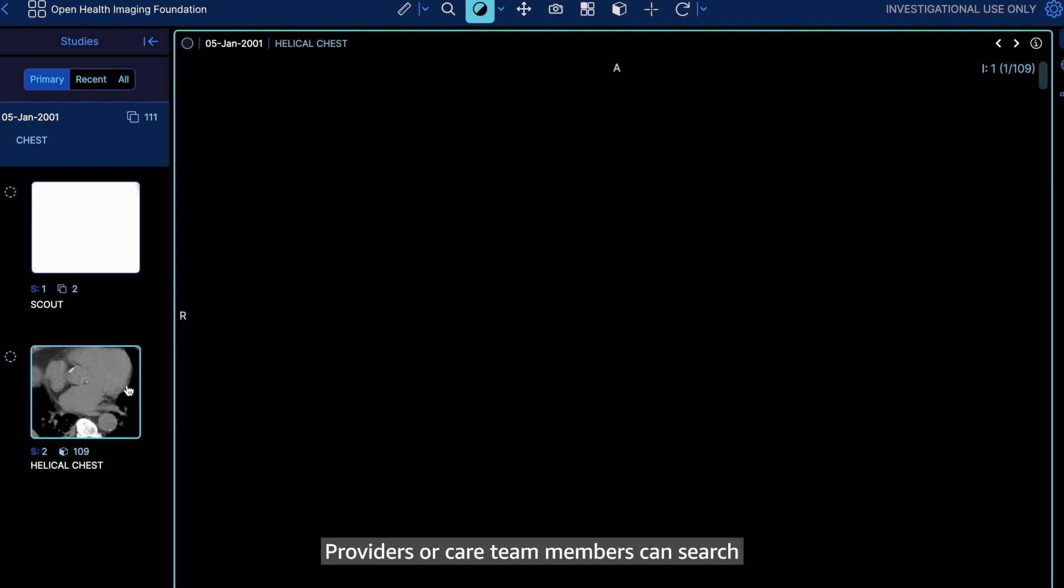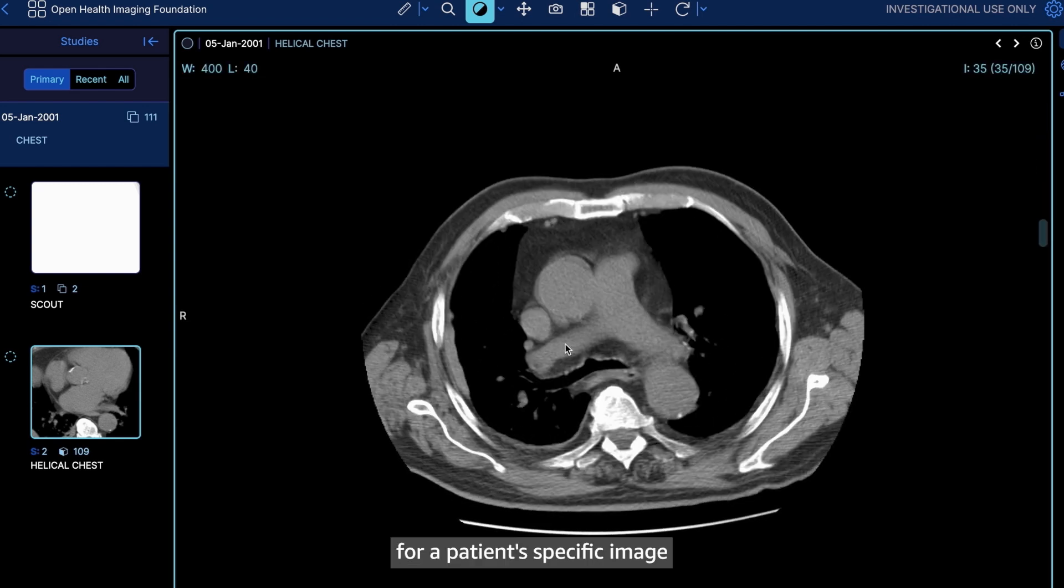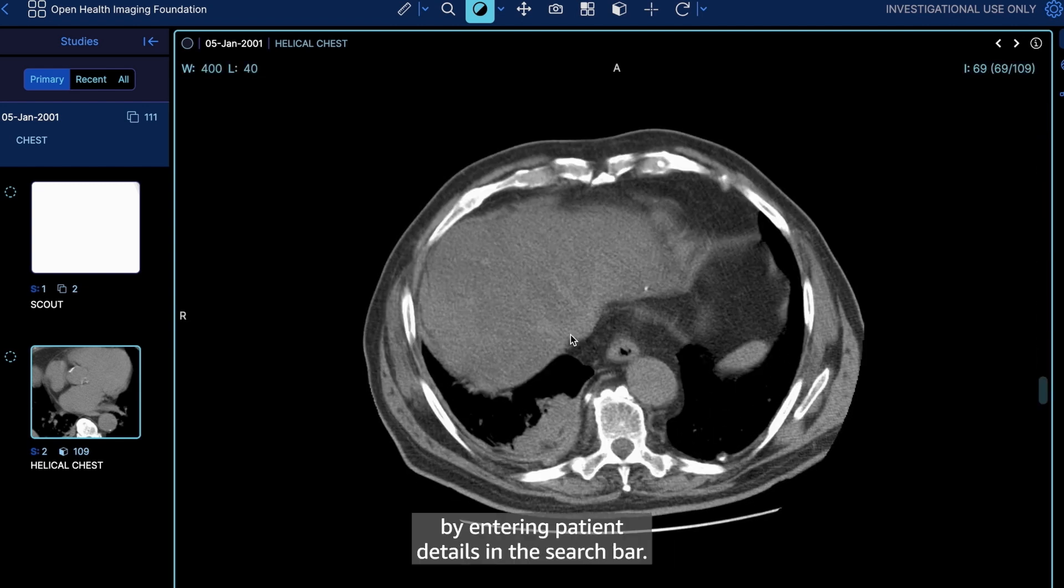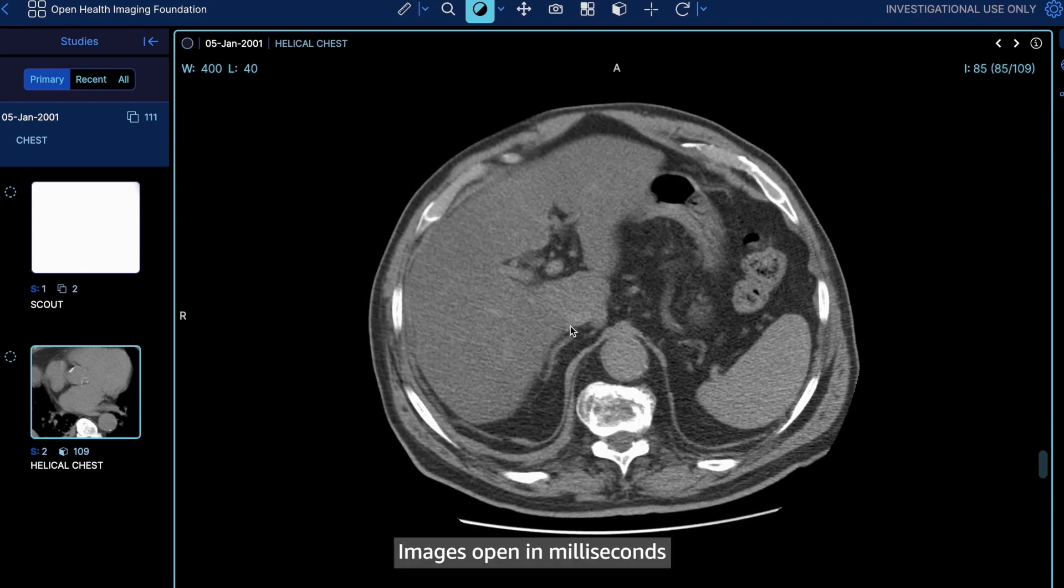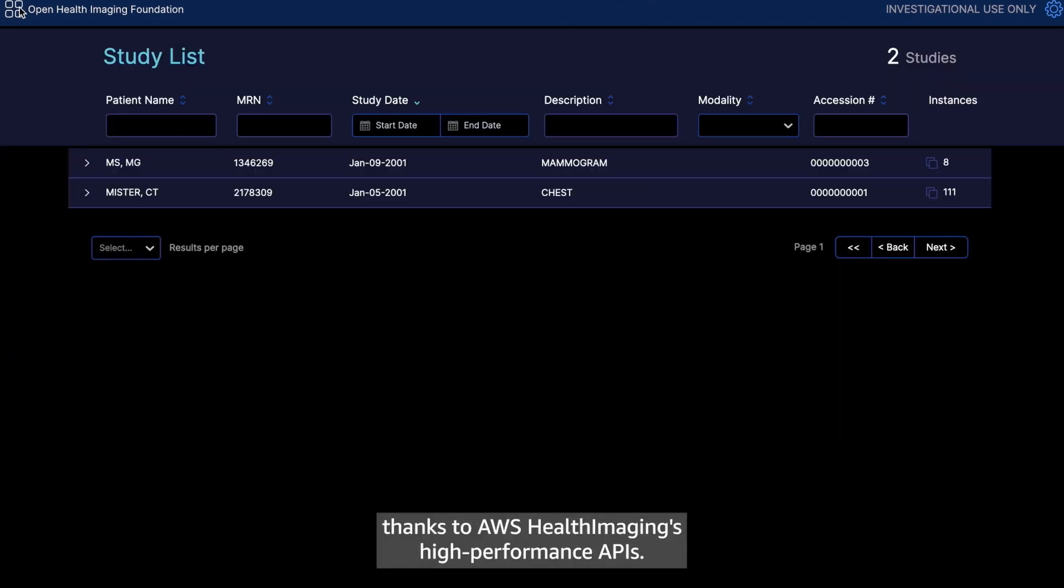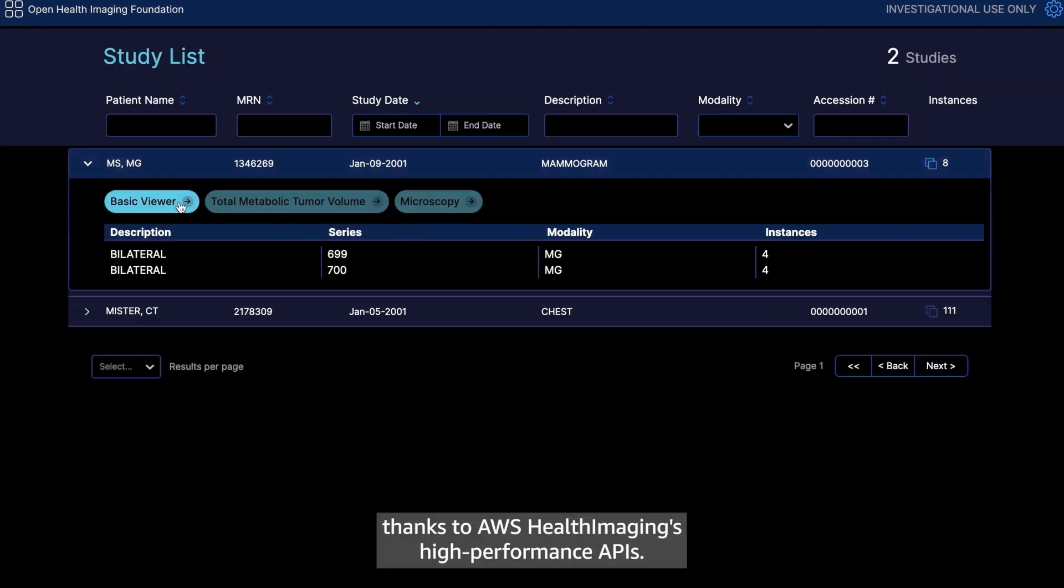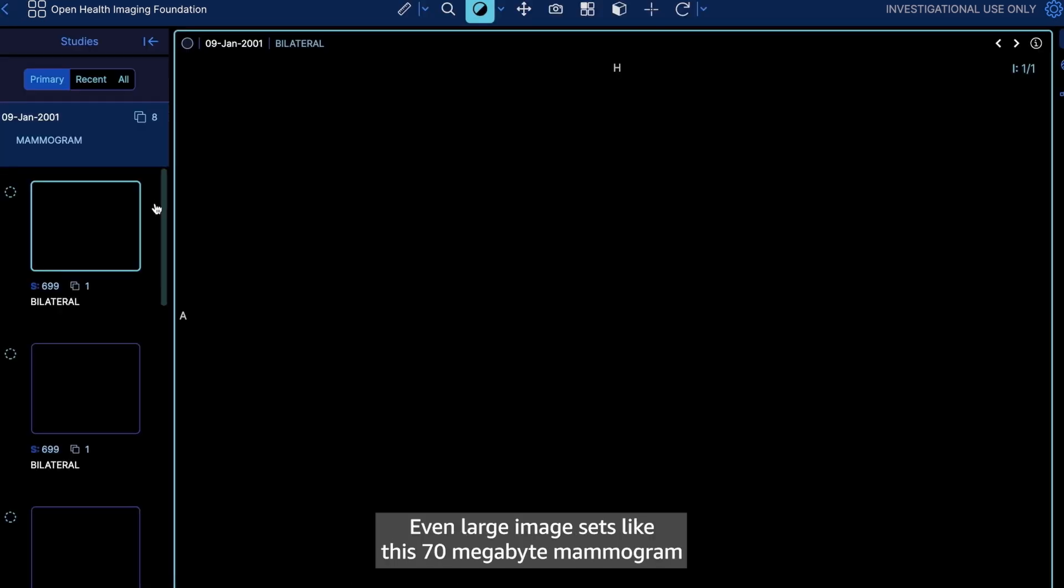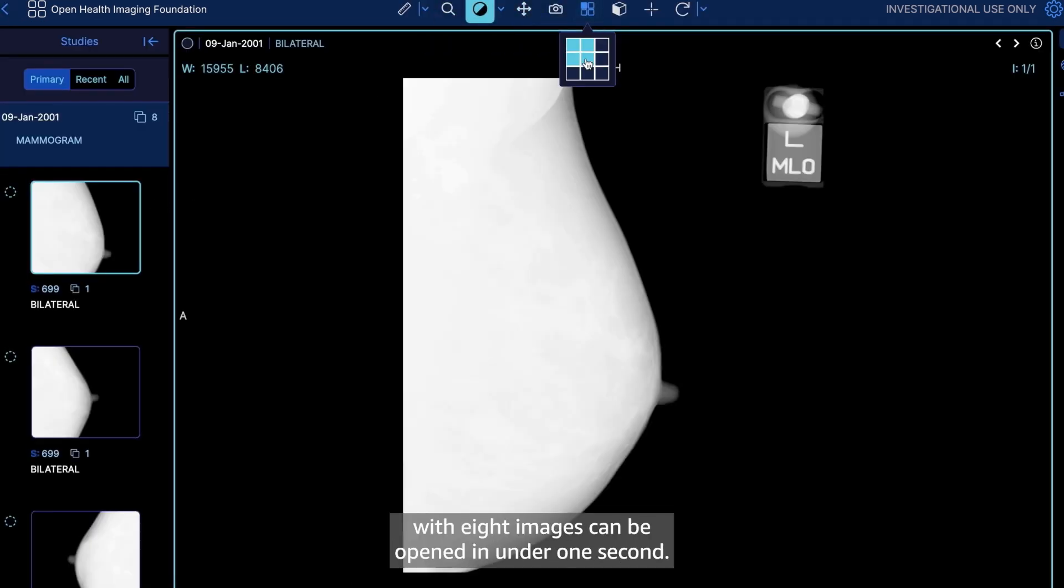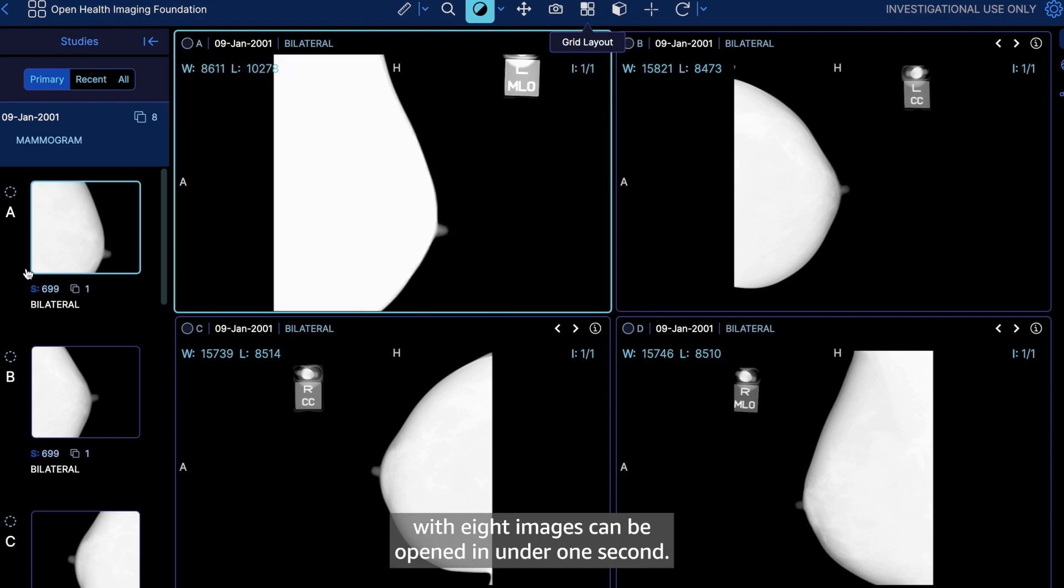Providers or care team members can search for a patient's specific image by entering patient details in the search bar. Images open in milliseconds thanks to AWS Health Imaging's high-performance APIs. Even large image sets, like this 70 megabyte mammogram with eight images, can be opened in under one second.